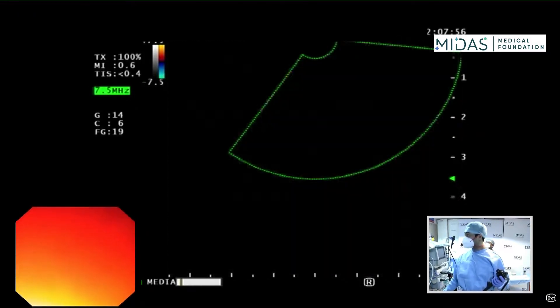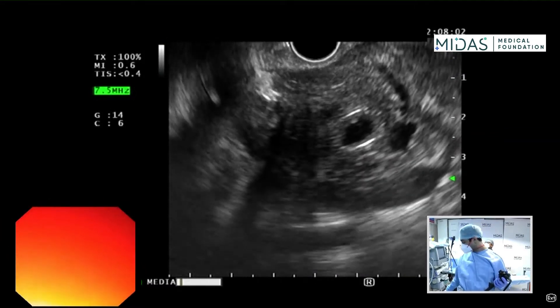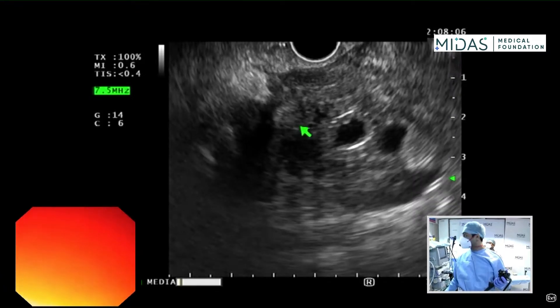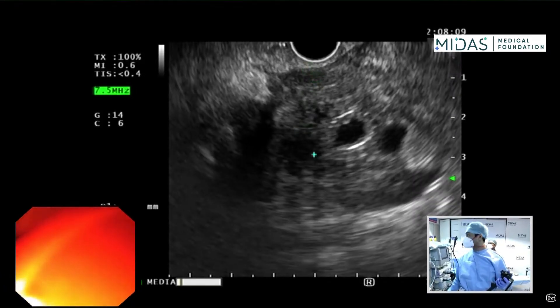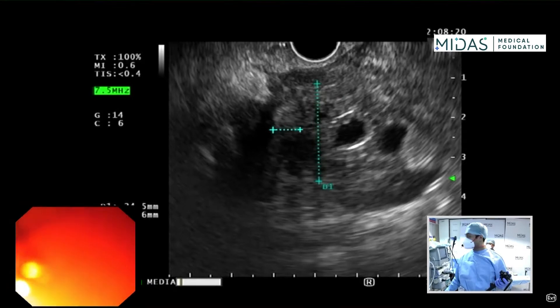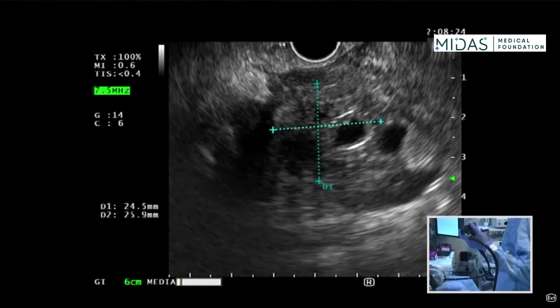I'm going to start by using Doppler to make sure there are no major blood vessels along the way as we get the FNB. We also need to measure the size of this mass, so I'm going to freeze the image and use my calipers — starting from here, going all the way down — then use another set of calipers for the lateral dimensions. This is about 2.5 by 2.5 cm, corresponding to the size shown on the ultrasound.